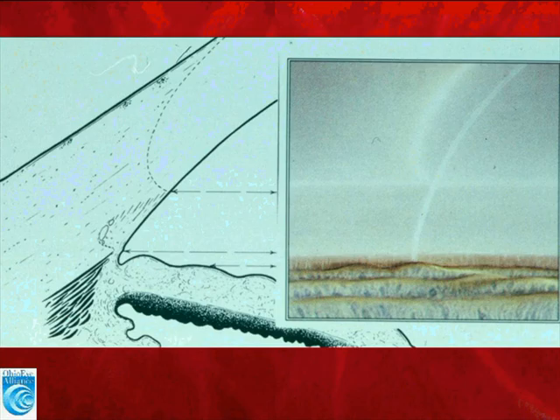In this drawing, what we see is superiorly in the gonio image, we can see a wedge of light. We see a beam to the right, which is the inner beam of the slit lamp following along the endothelium. On the left, we see the light coming together in a wedge in a more diffuse, slightly hazy beam, and this is the light reflecting off of the anterior surface of the cornea and then following the corneal tissue to where it terminates at Schwalbe's line.